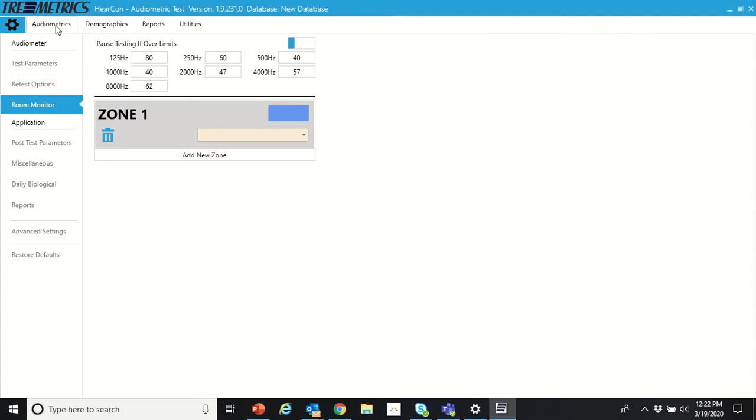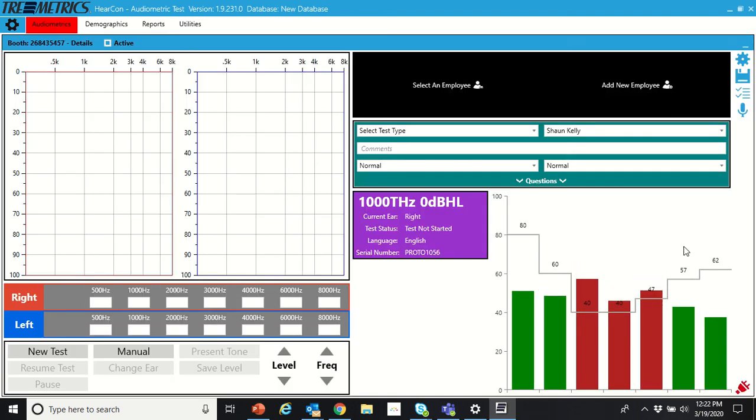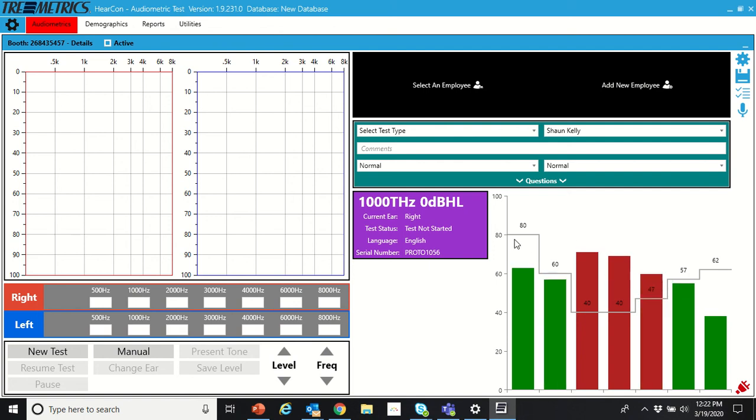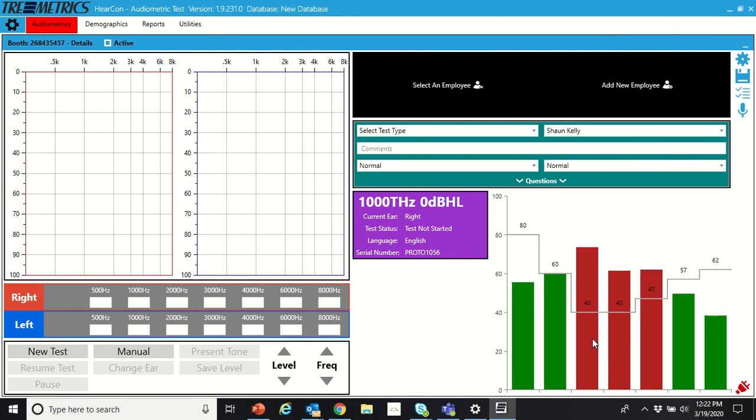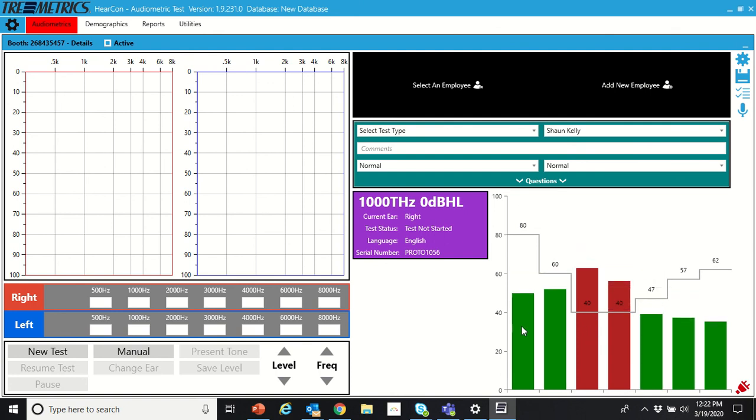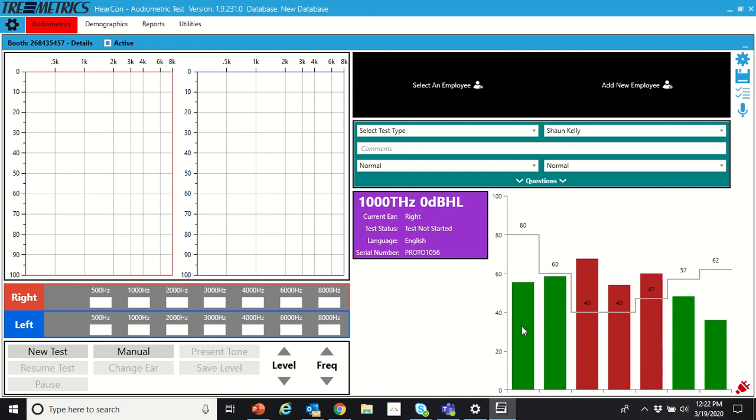If we go to audiometrics, we can see the room monitor down there. These horizontal lines are the limits we have set for those different octave bands. You can see it's red when it's too loud and green when it's below the limits. That's the room monitor function for the RA-660.